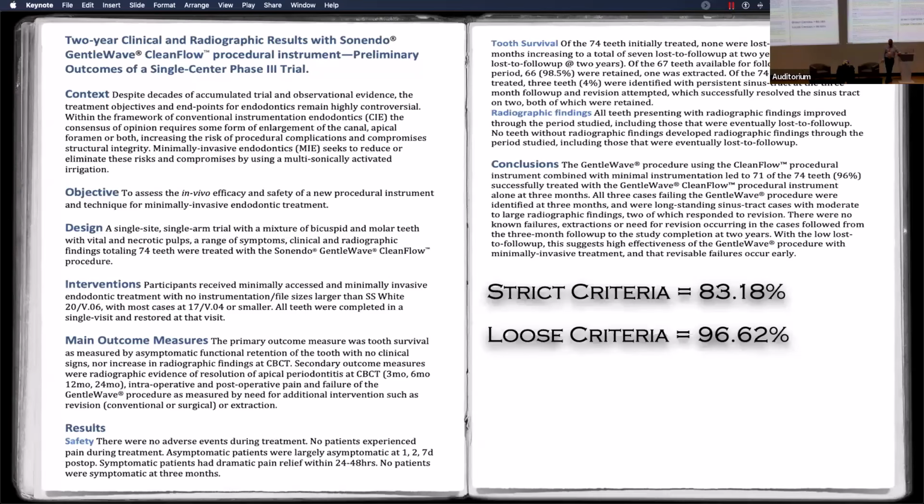Because that's actually the only really reliable indicator that the file is touching the periapical tissues. We all know as endodontists that when it says 0.5 millimeter short, it's like, yeah, 0.5 to 5, who knows, especially on a retreatment case. So full tone, which is actually out the apex a quarter to a half millimeter, is best evidence.